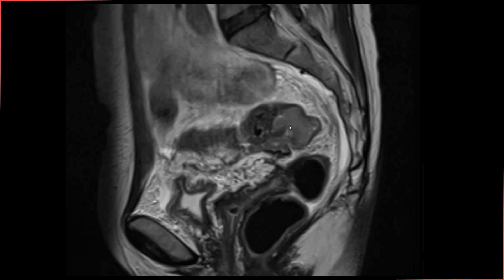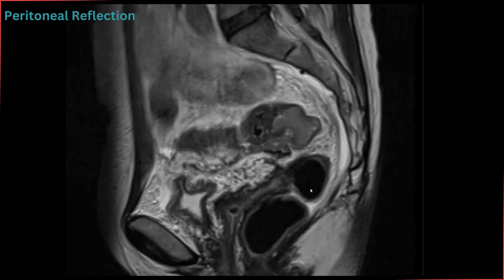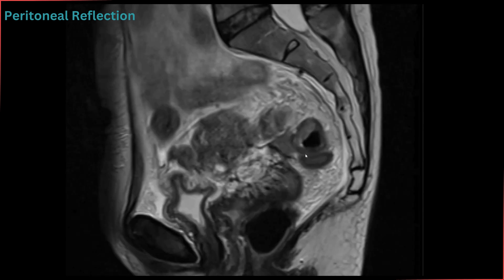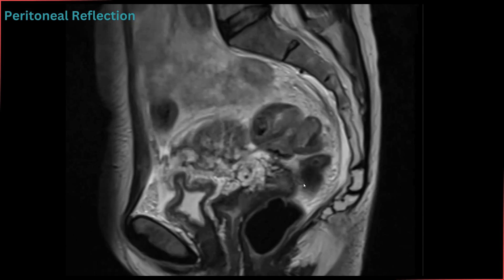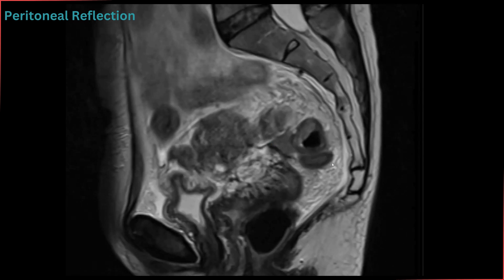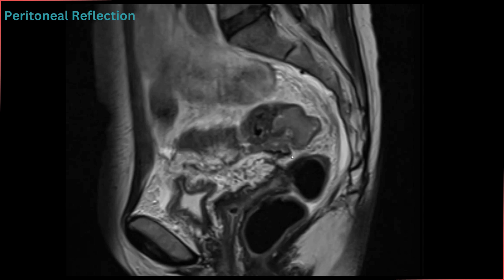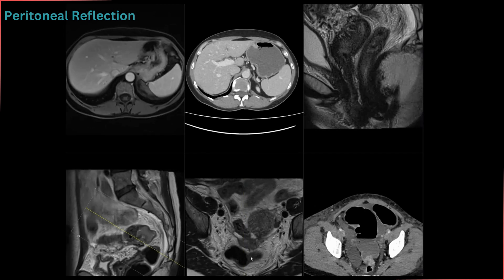This tumor appears to extend outside of the rectal wall, extending anteriorly. Do you remember the band-like thickening we discussed in our rectal MRI anatomy modules? This is the peritoneal reflection, and in females it is identified just above the cul-de-sac. The cul-de-sac lies between the rectum and the cervix, and you can see a band of thickening between these two areas. The typical V-shaped appearance is not seen here because the tumor has infiltrated this peritoneal reflection — this would be nicely seen on axial images as well.